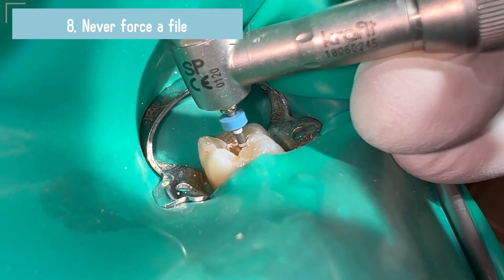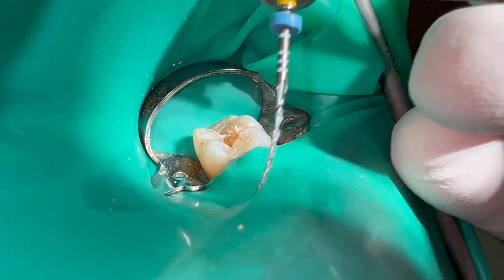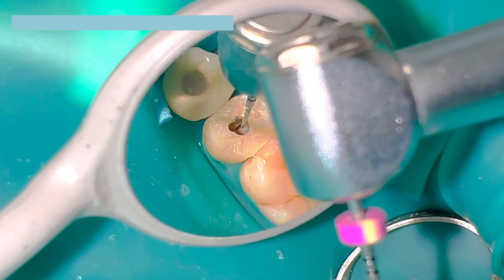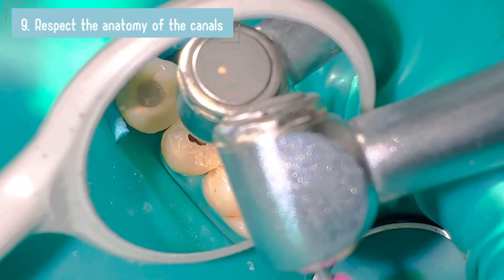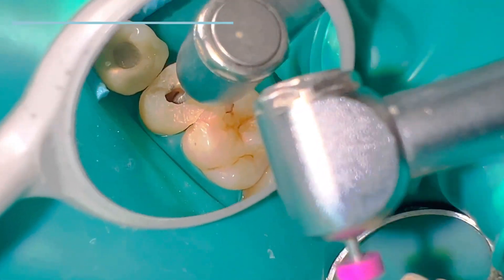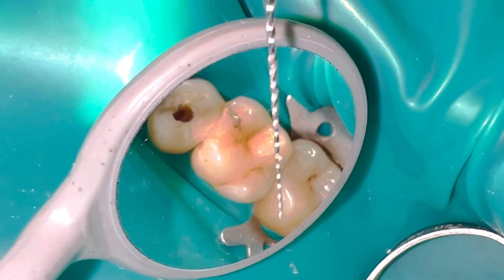If you try to force a continuous rotary file it will cause a torsional fracture. You have to try to work the canal according to its anatomy. If it is a narrow canal it is logical to think that we will not work with large diameter files, and thus avoid forcing them.